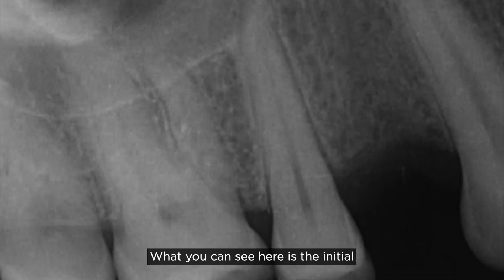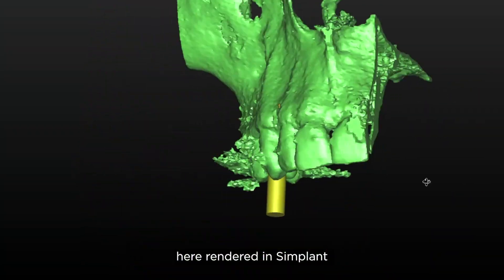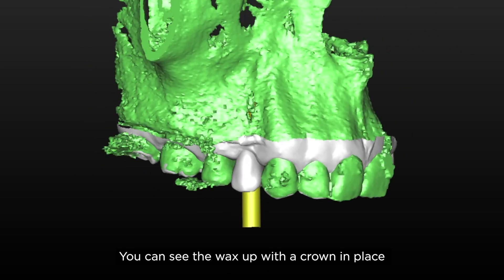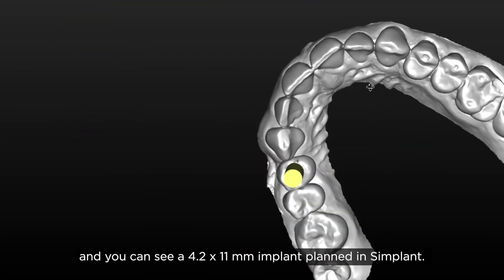What you can see here is the initial radiograph taken. From the CT scan and the intraoral scan rendered in Simplant, we have a small buccal bony defect present. You can see the wax-up with a crown in place and a 4.2 by 11 millimeter implant planned in Simplant.